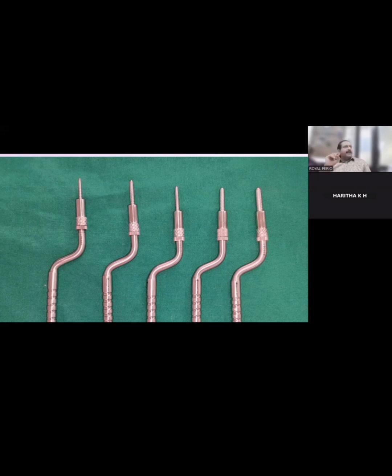Once you have fractured the sinus floor, you can even place another 1 millimeter into it. It will not harm you much. Do you understand this point? Once you have broken the sinus floor, you can place 1 or 2 more millimeters of the implant, because this is indirect sinus lifting. So to fracture that sinus floor, what should be the minimum height adjusted? 8, because it's already 6.5.